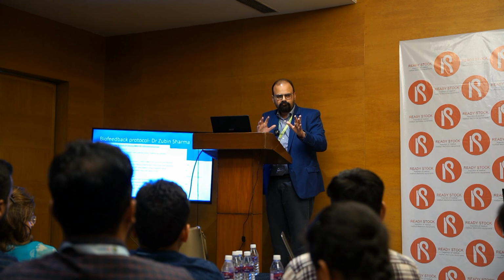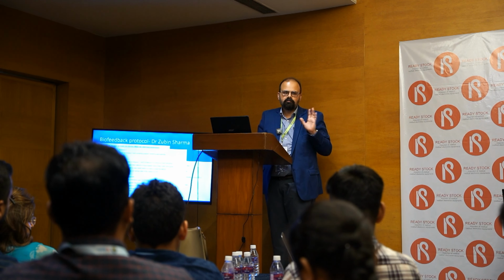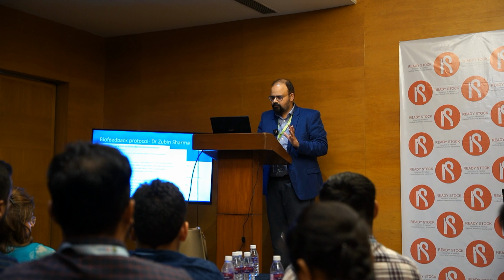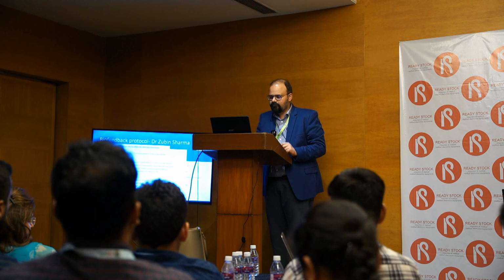So this is usually by session 5 or session 6 that I give them. After that, I am sure they have done well on the machine. So after completion of this phase 3, when they have done well, I give them that Foley's with the glove.